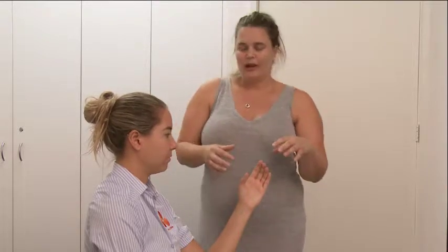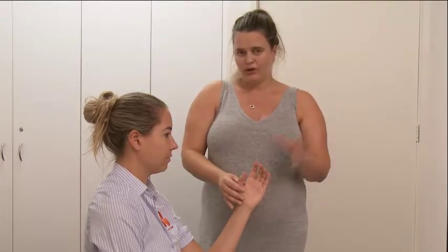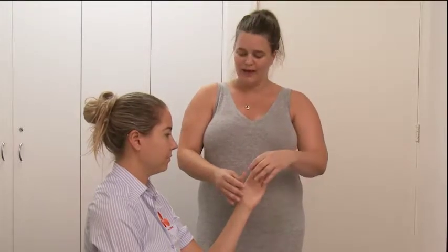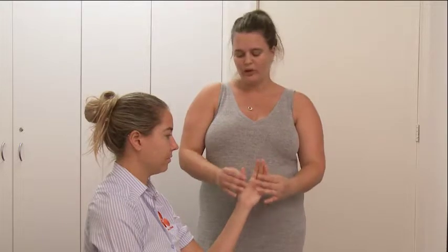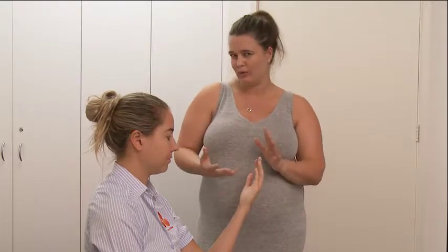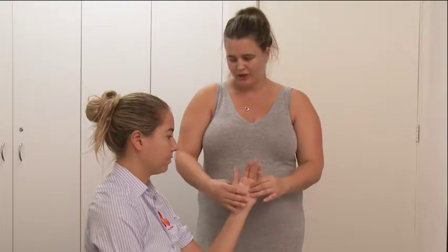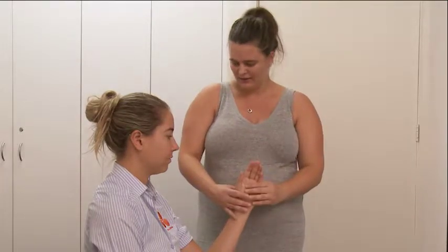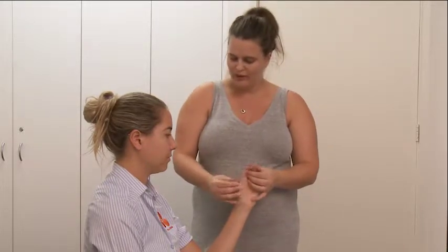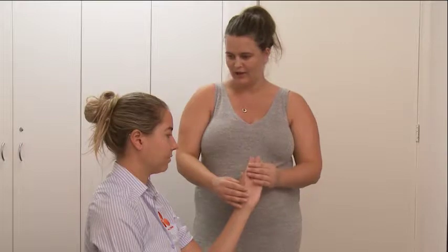When you start, give your patient really clear instructions on the position you want them in. A lot of patients will try and be helpful — they'll move their wrist out of the way, open their thumb up, or turn their hand to face them to have a look at what you're doing. So really clear instructions on keeping the hand nice and still. You're going to have thumb to index finger, and when I come round with the material, rather than move your thumb out of the way, you're going to move your hand out of the way.